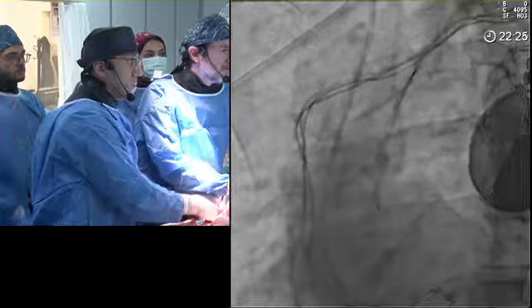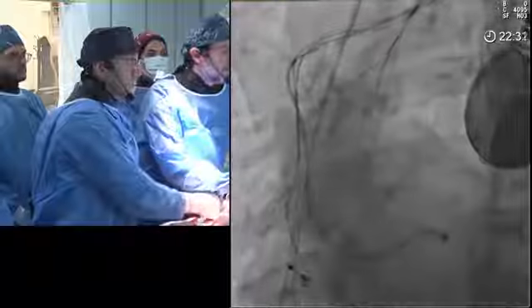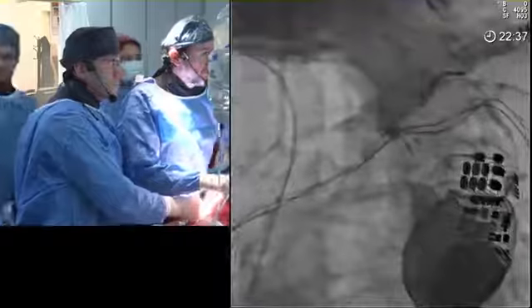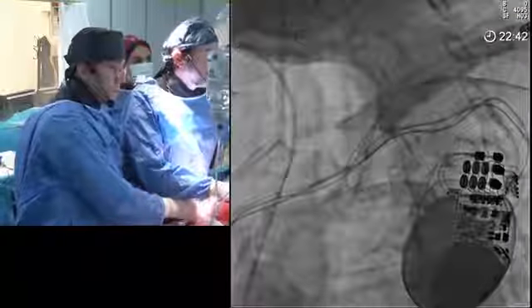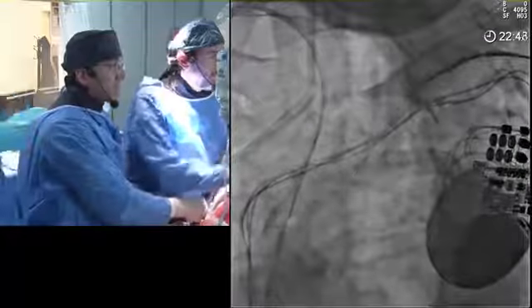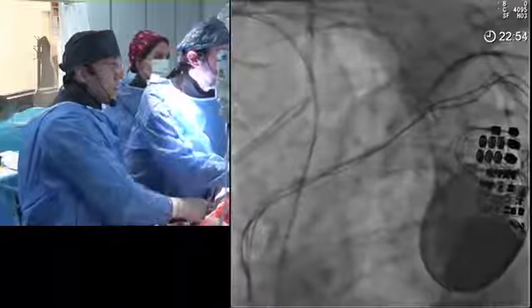Baktash: Yes, please, can I make a comment? I appreciate that the retro injection looked like you're in the aorta, but I had a feeling that it probably traveled in the aortic wall a little bit before exiting. I've been in that situation before. The fact that he couldn't move the retrograde microcatheter with the antegrade guide is suggestive of that. And yes, sure, you can snare this, but it's quite possible that you may be travelling in the aorta.